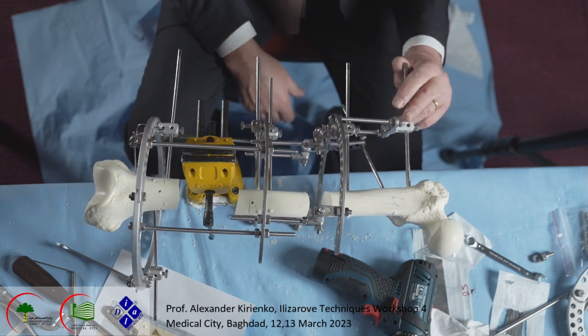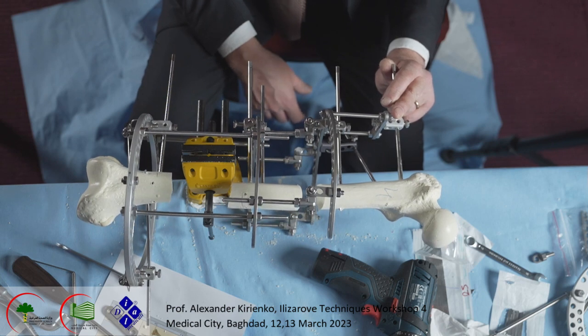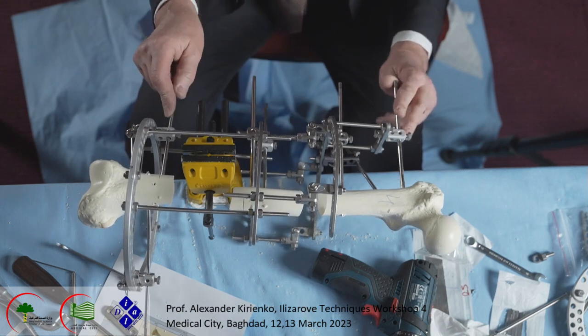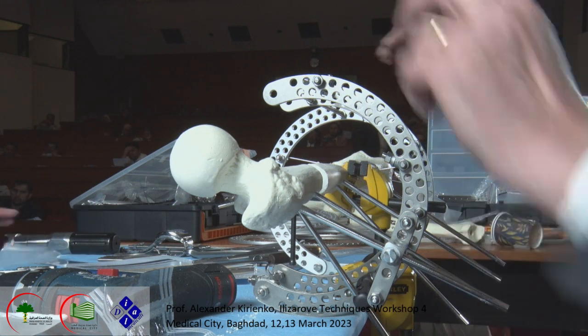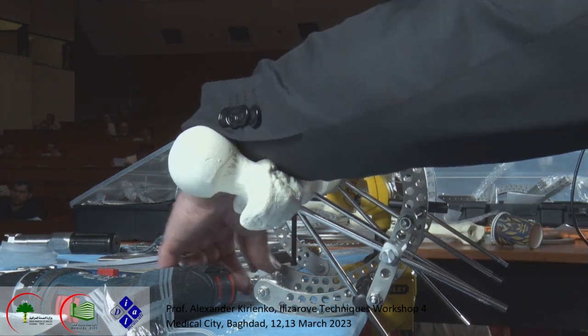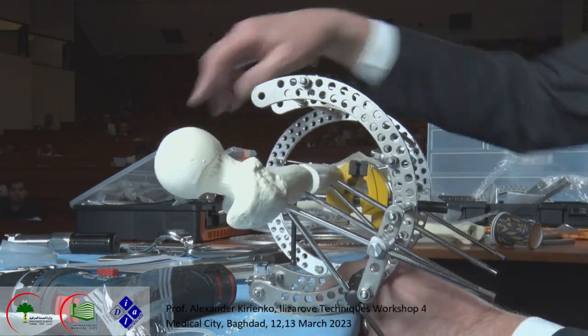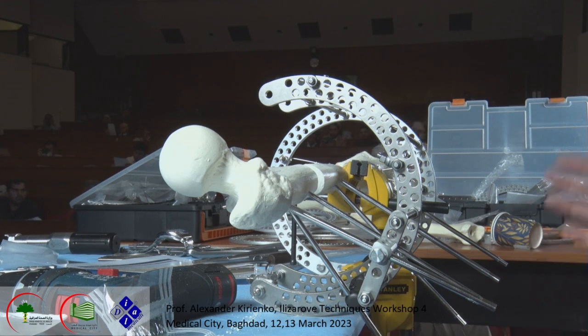If the defect is so big, maybe you don't need to do complete restoring of the defect. You may leave the shortening of the leg. In the future, you may do another lengthening. But if it's possible, it is better to do all this treatment one time.